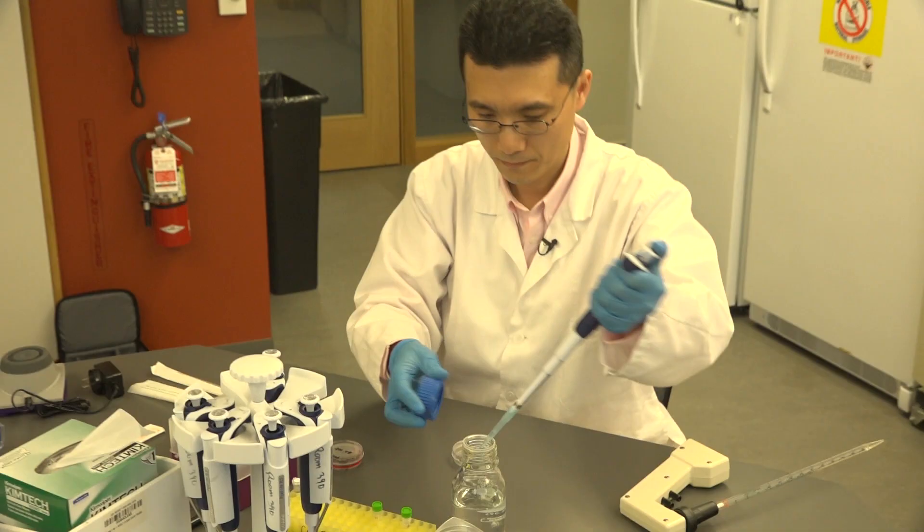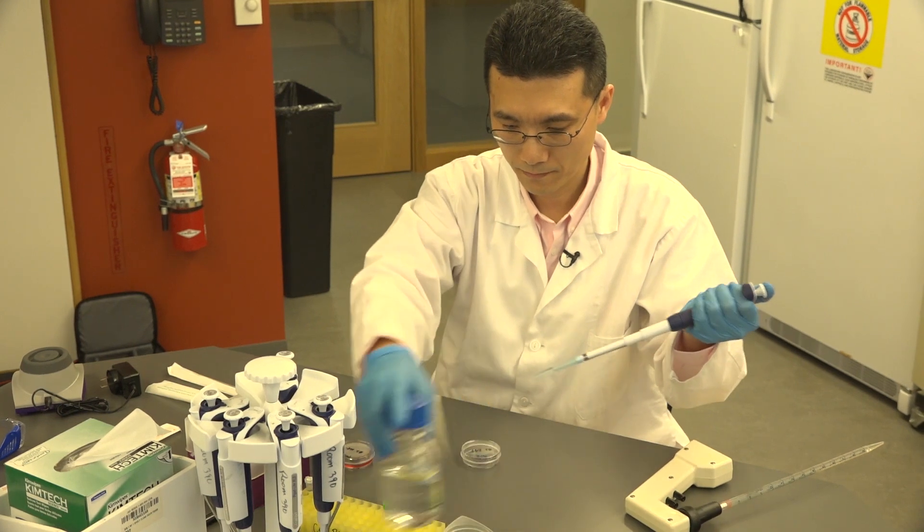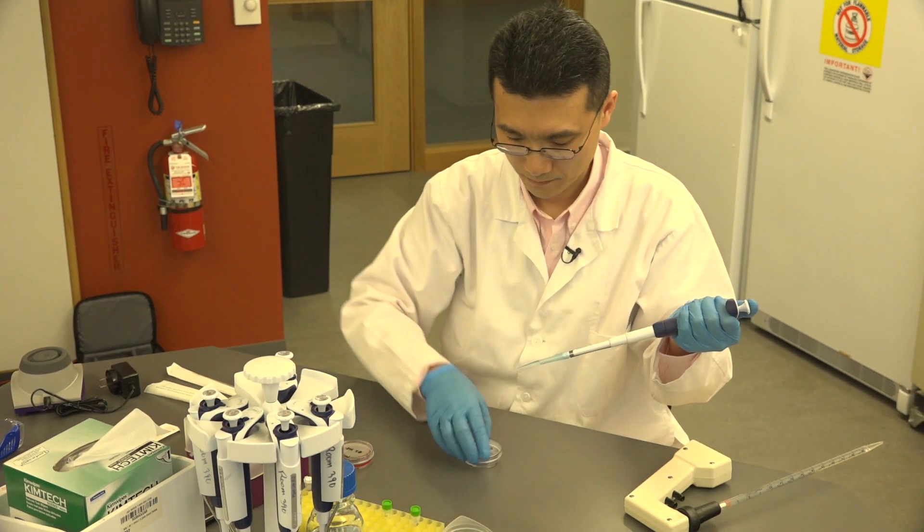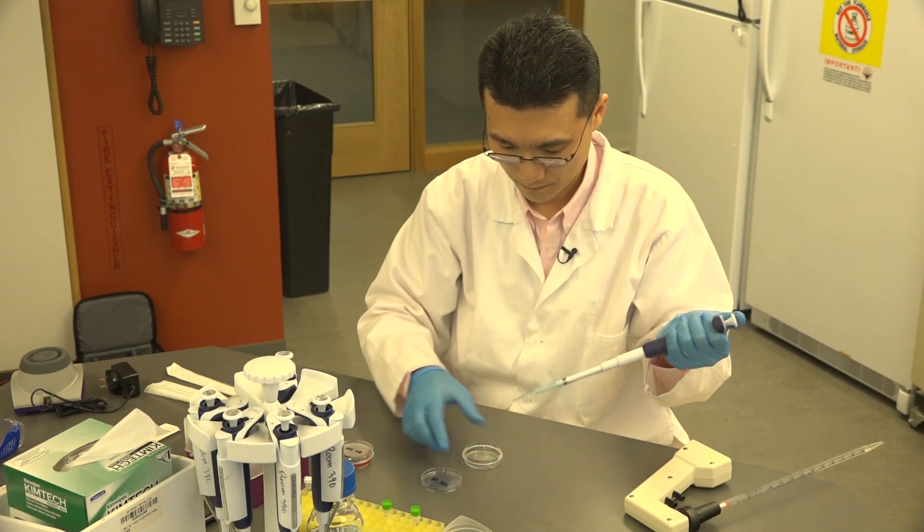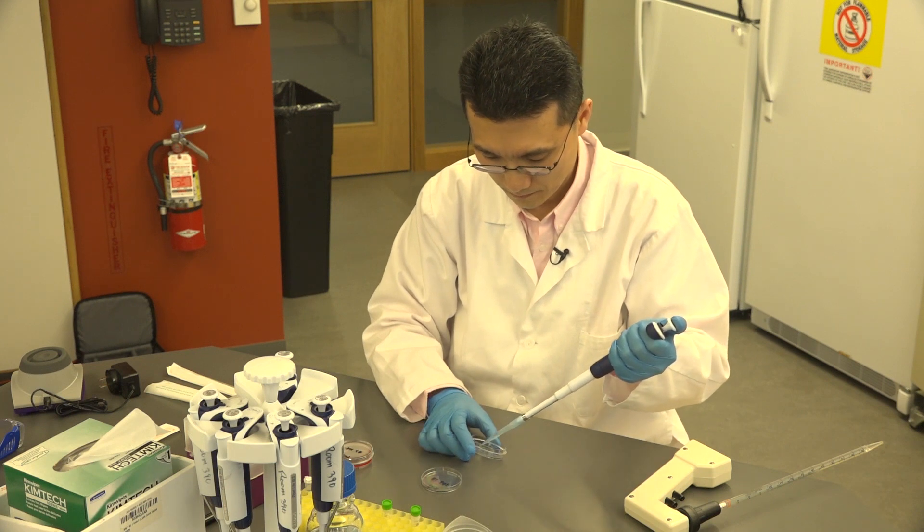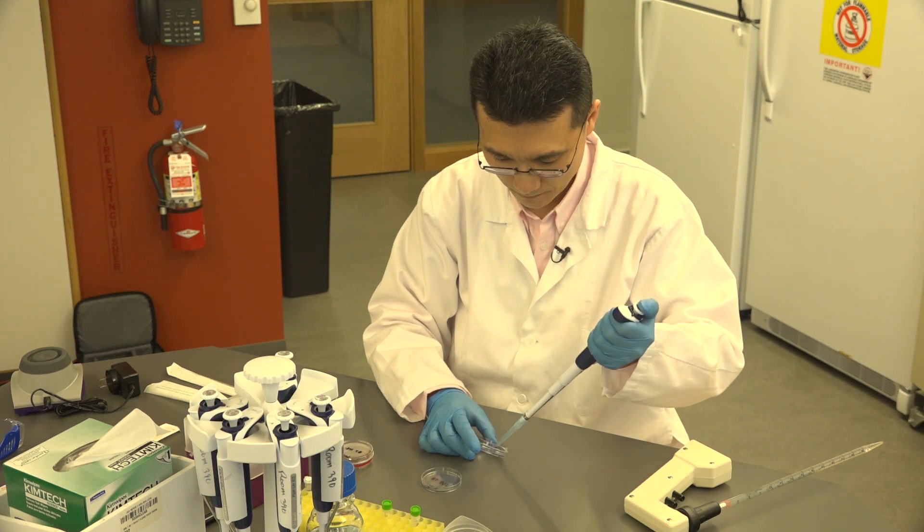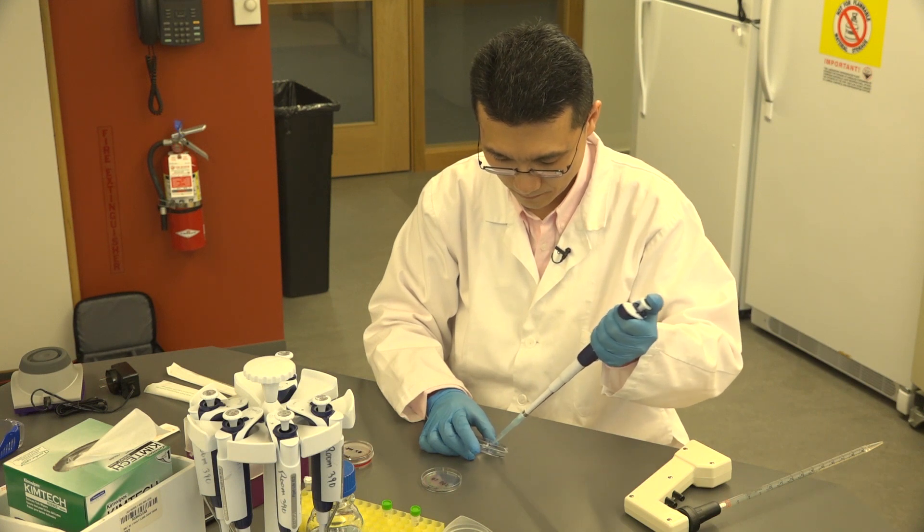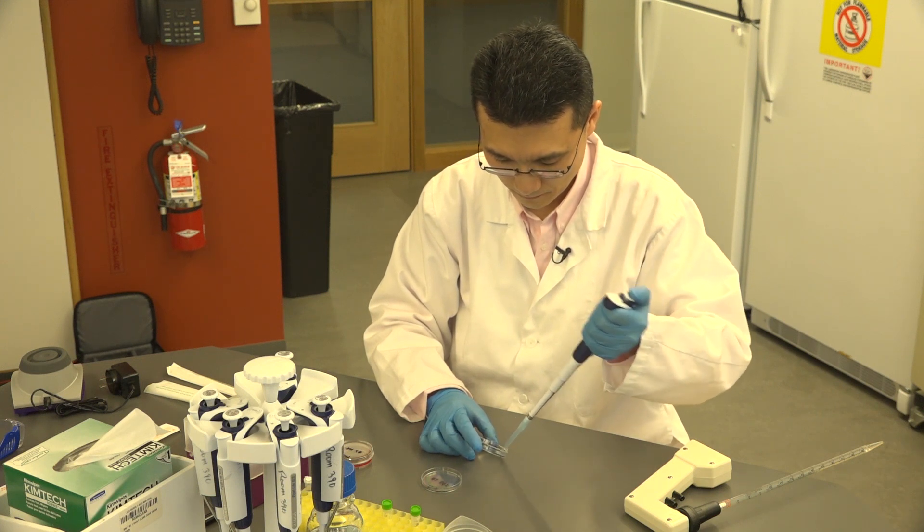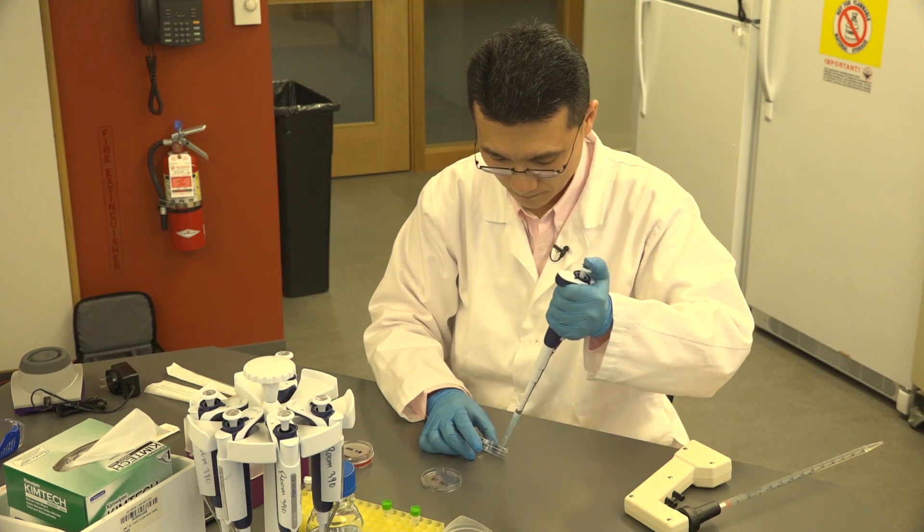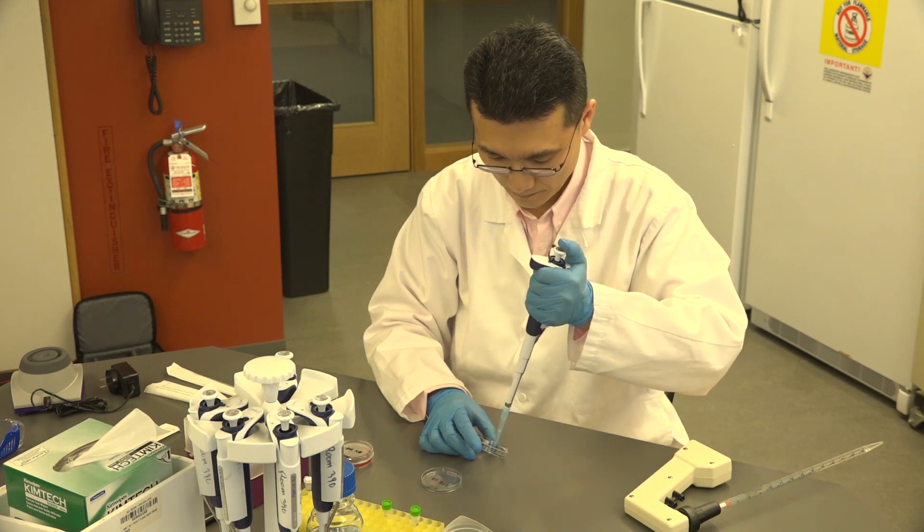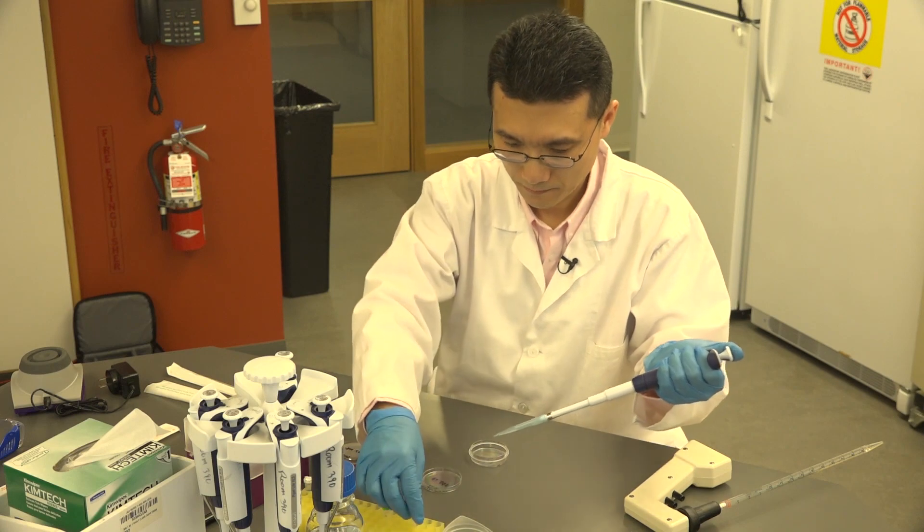Pipette an additional 500 microliters of TBS into each dish to recover the remaining cells in the dish. Again, tilt your dish and rinse off the cells to the bottom corner. Then pipette all the cells into the 2-mil tube containing the first 1-mil cell suspension. Remember to use a new scraper for each dish.